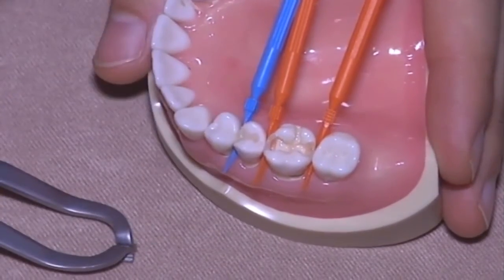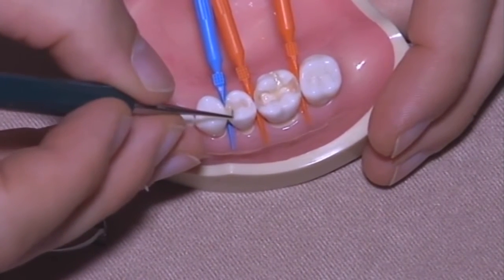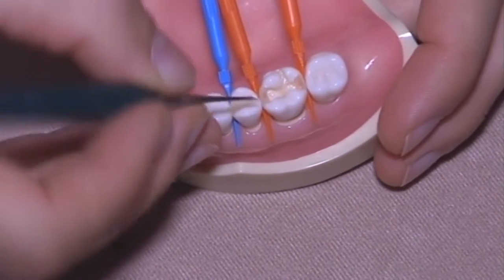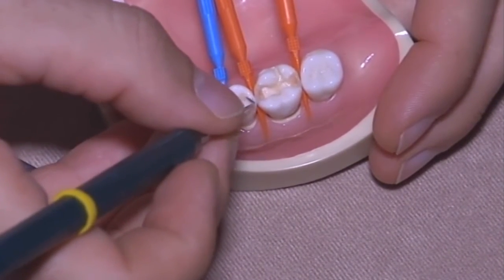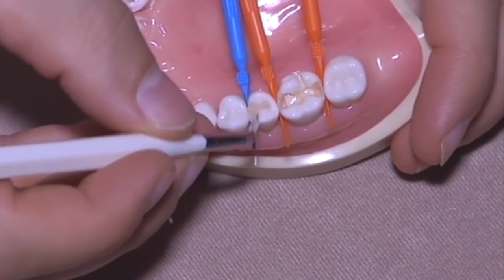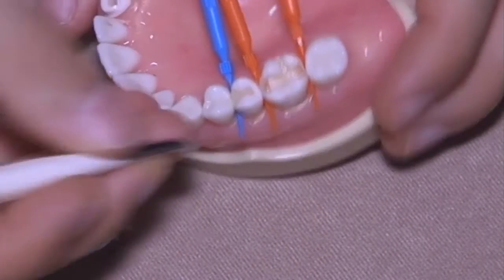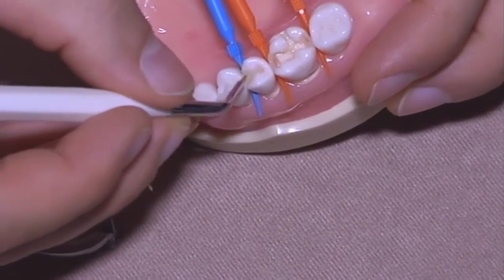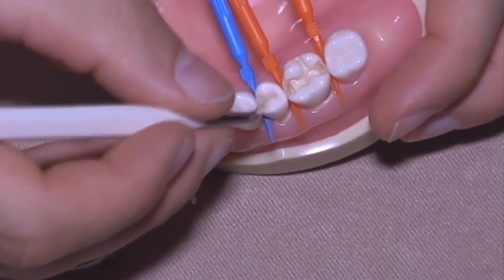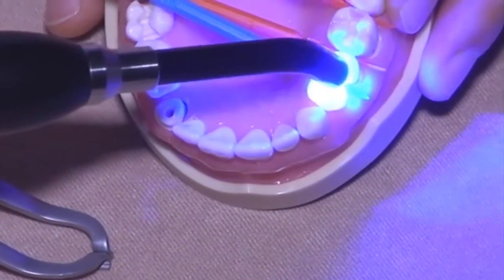And then you just have to design 2 fissures, and the brush here helps you a lot. Okay. That's done.